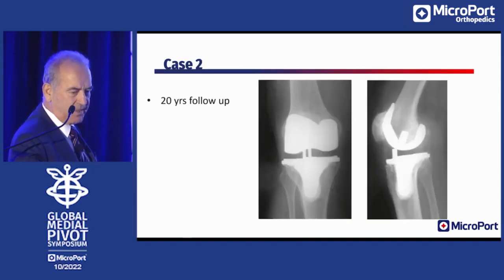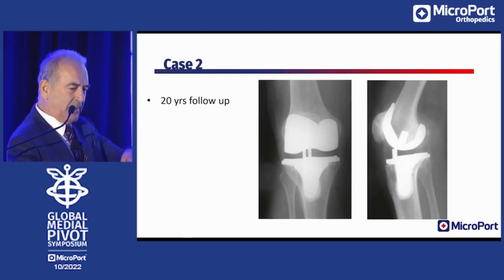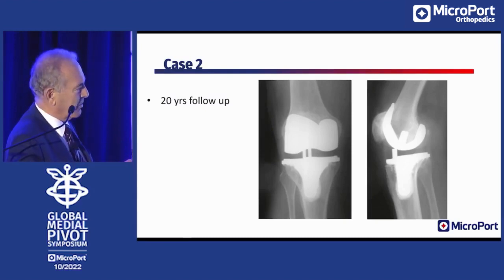Another case, 20 years follow-up. You don't see that much wear of the poly. There is some demarcation line in the medial side, but the component's absolutely stable. It's 20 years follow-up. I don't think we could expect any better.